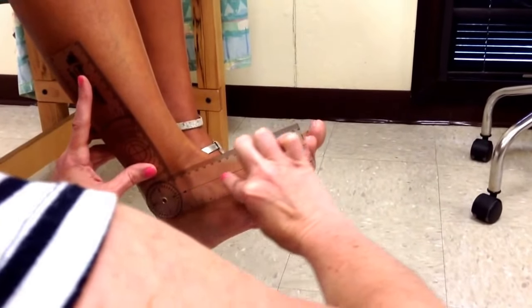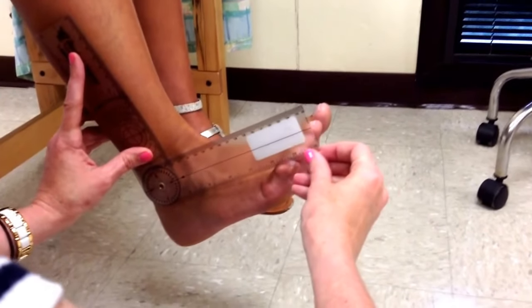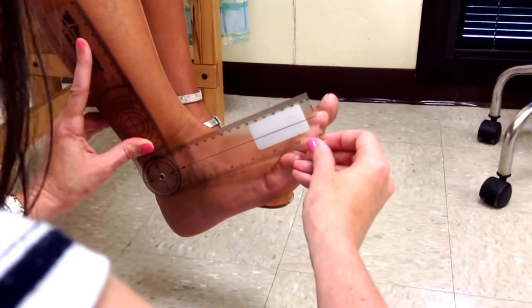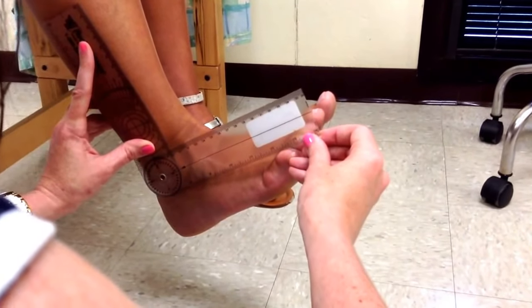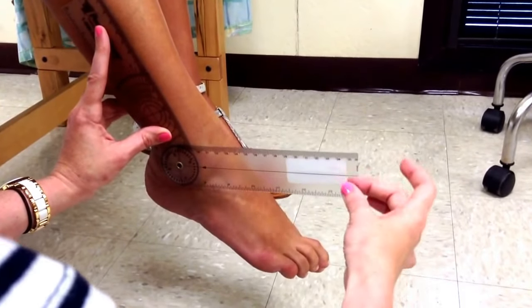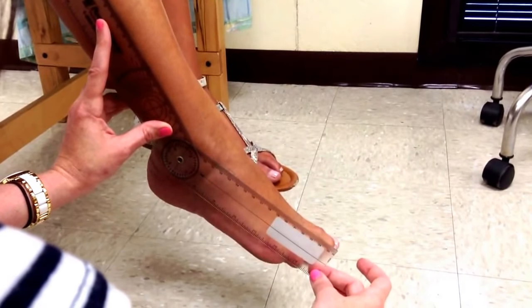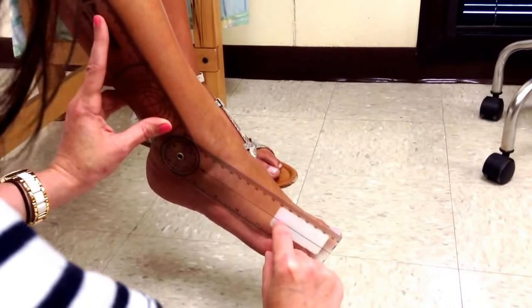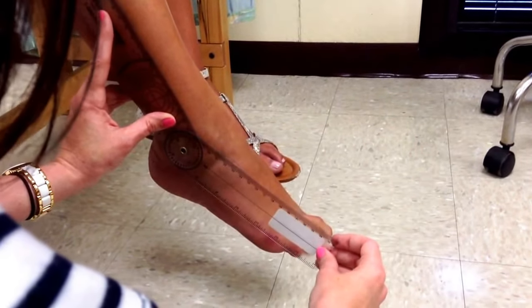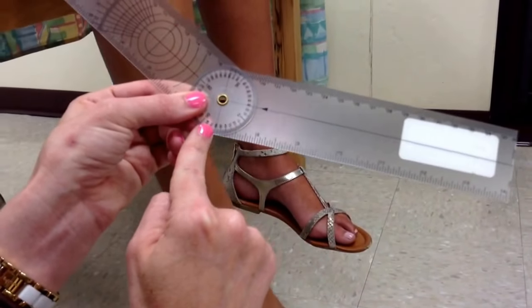The moving arm needs to be parallel with the fifth metatarsal, like this. She's got five degrees of dorsiflexion. Then if you point your toes down like a ballerina — plantarflexion — the moving arm again needs to be parallel with the fifth metatarsal. She has 60 degrees of plantarflexion.